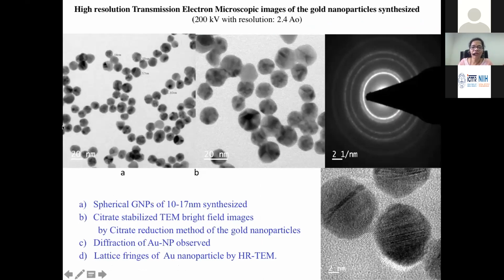It's a gold nanoparticle labeled test, and the size and the shape of the gold particles are extremely important. This has been done with the help of IIT Mumbai and UDCT Matunga, because all these nanotechnology facilities we do not have at NIH. So they have helped us in getting this done.